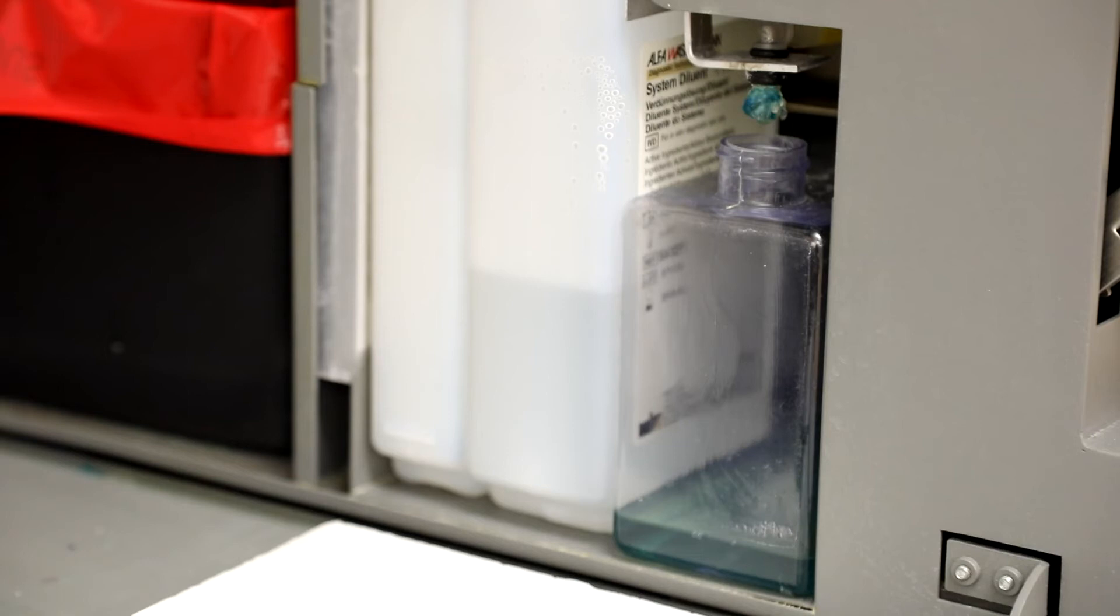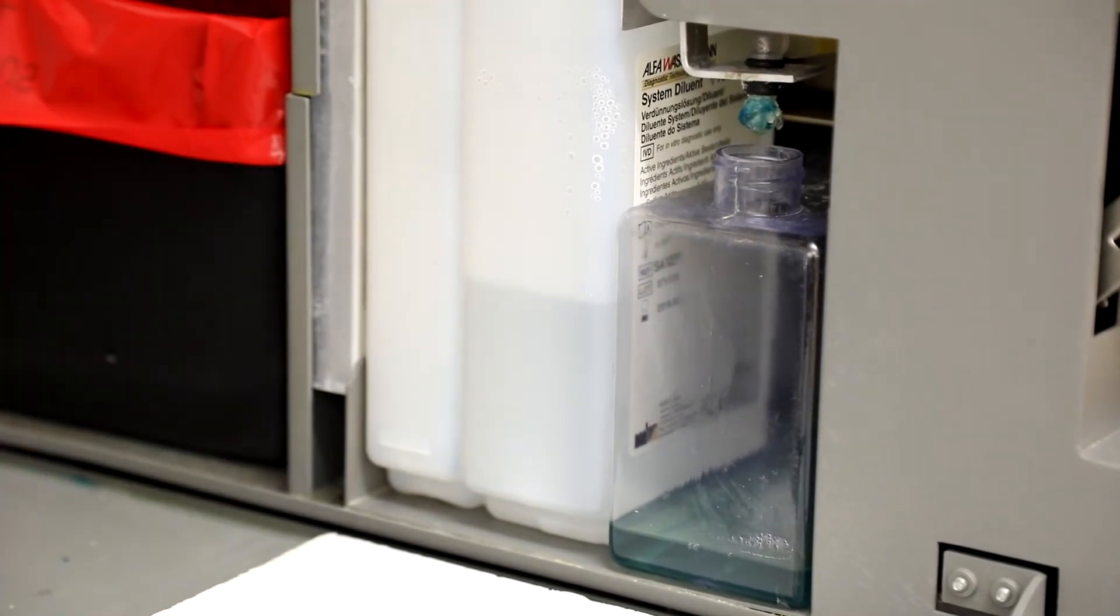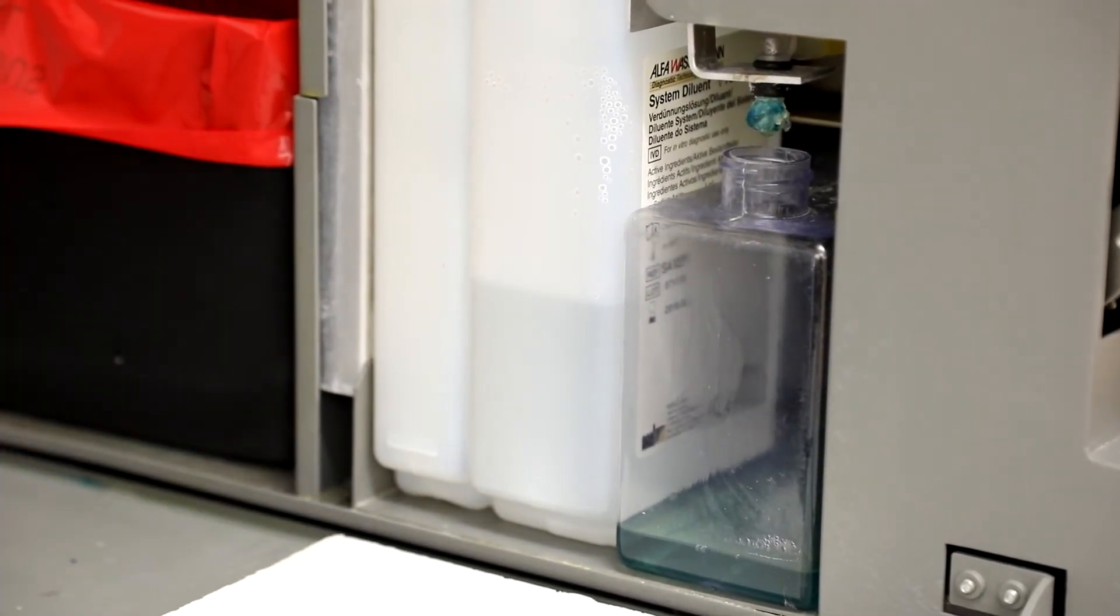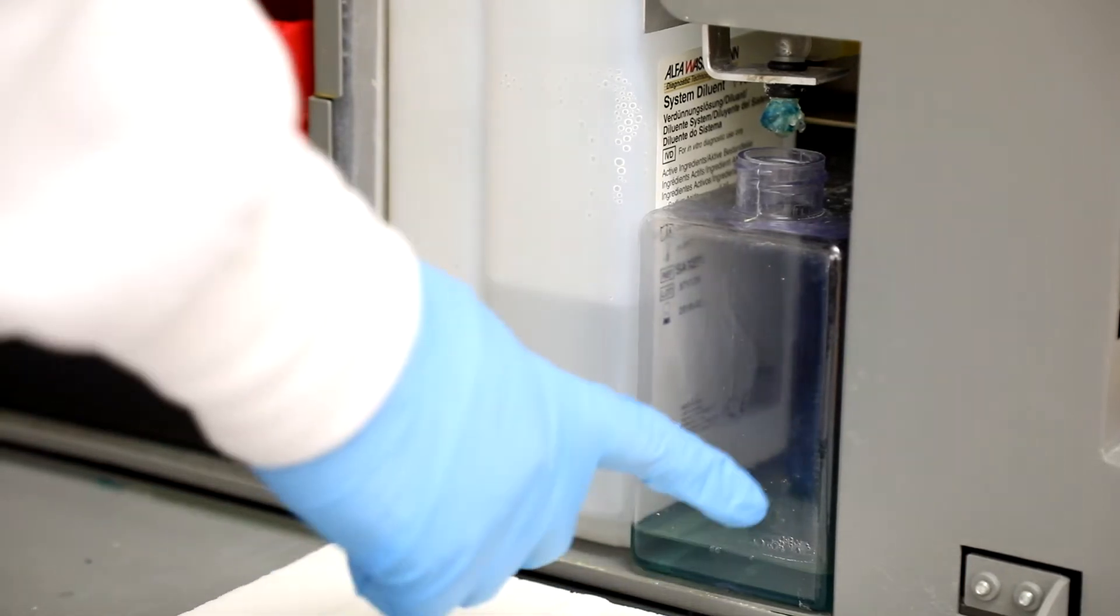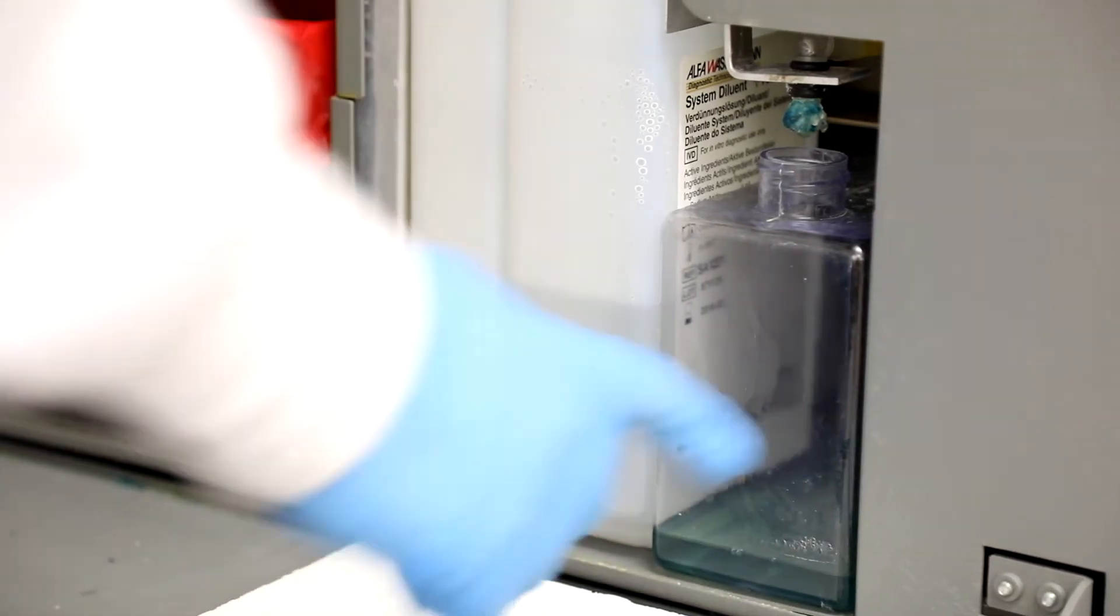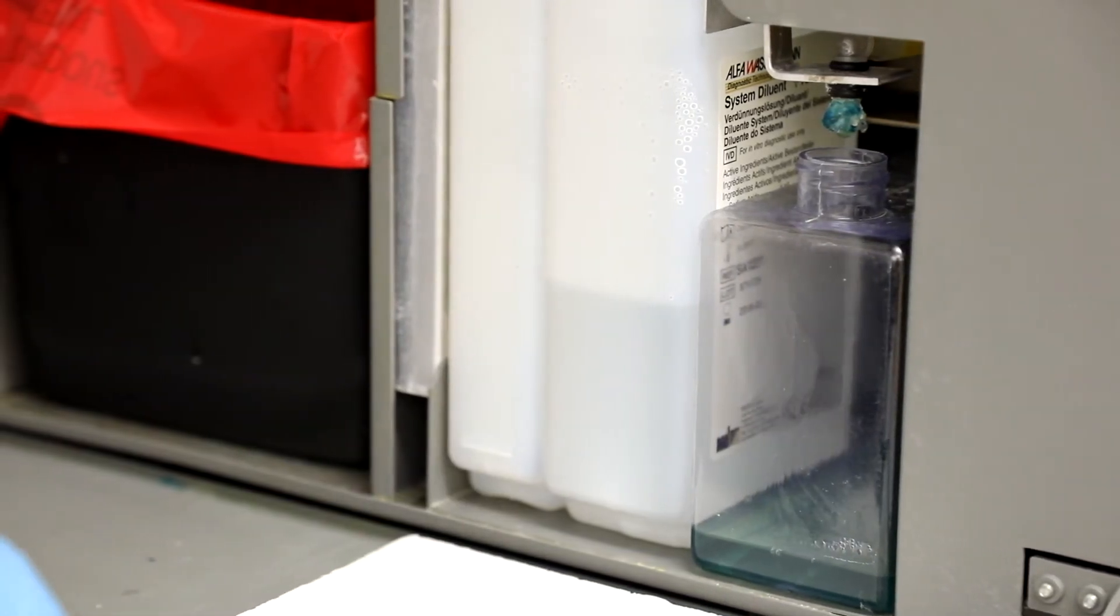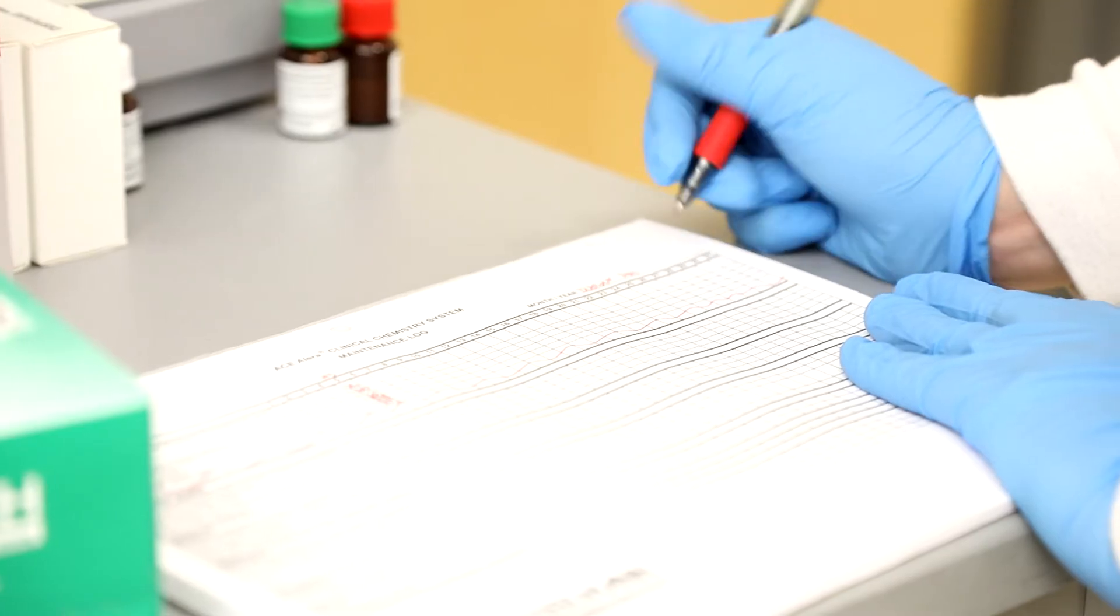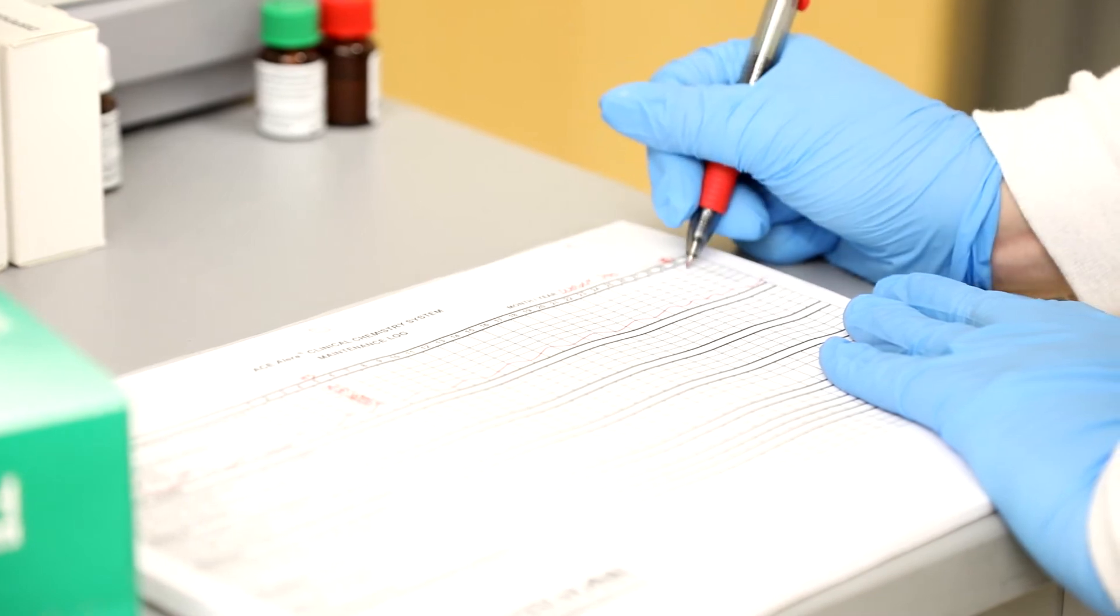Next, check the fluids. The fluid in the middle bottle should be full. The one on either side should be empty. This concludes Daily Maintenance. Be sure to initial on the maintenance form.